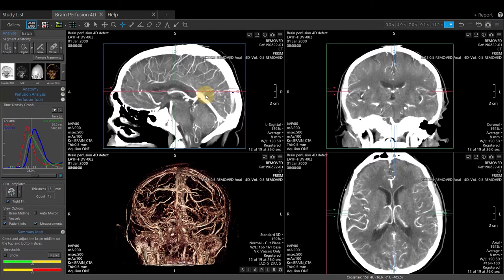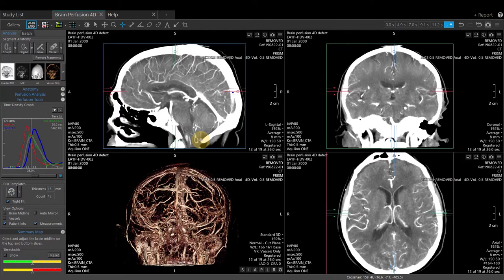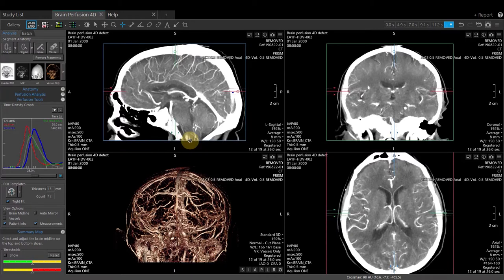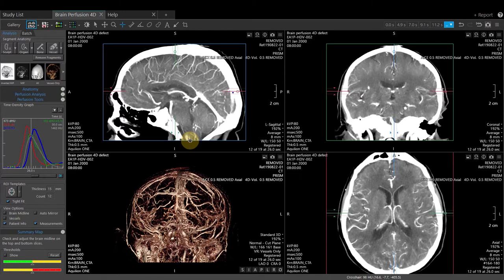To do this, first trim the dataset, especially at the inferior portion of the image. To trim, hover over the blue line, left click, and drag up. This will eliminate some motion near the jaw.